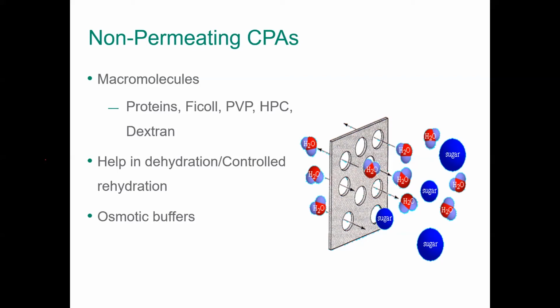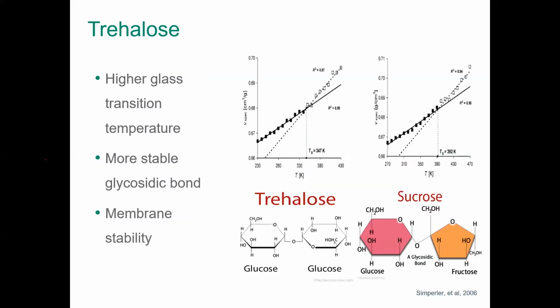Also, adding the non-permeable cryoprotectant to the warming solutions during the warming process helps to decrease the traumatic cell expansion during rehydration, and it also helps to stabilize the membrane. So that's exactly the function of permeable and non-permeable cryoprotectant. But we will talk a little bit more about the sugar that we add. Sucrose was the most commonly used one, and it's very efficient.